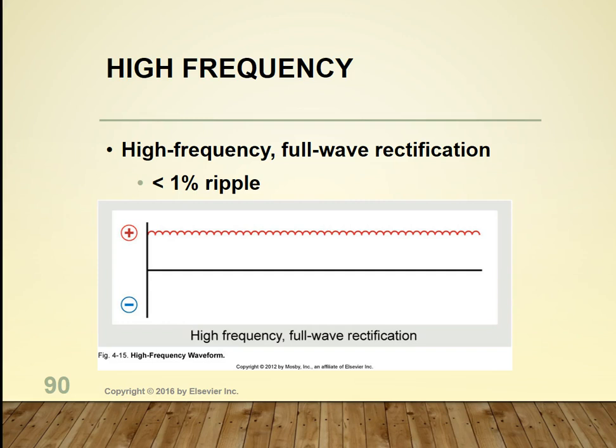So this figure is demonstrating the resulting waveform. These are usually smaller, lighter, less costly generators, and they offer better exposure reproducibility. So people should move up to them. The problem is when people have older equipment, they keep it because it's still working, but it may not be as efficient and they just don't want to spend the money to get something new.